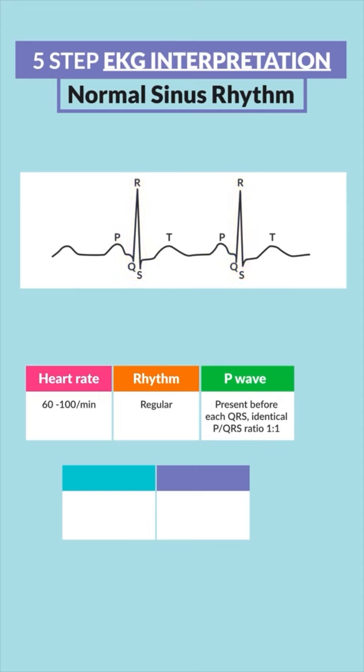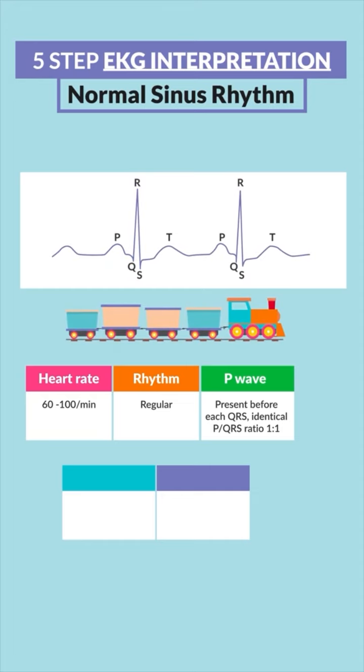It's kind of like the buddy system. Or I call these choo-choo trains. You have a little lump with a big lump.